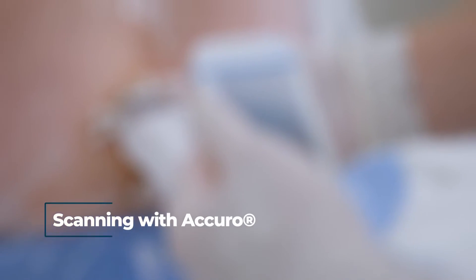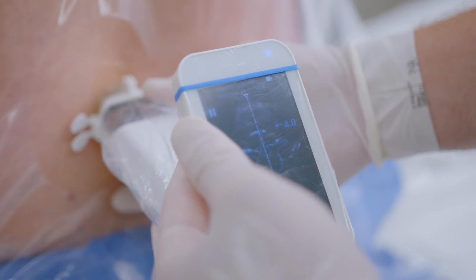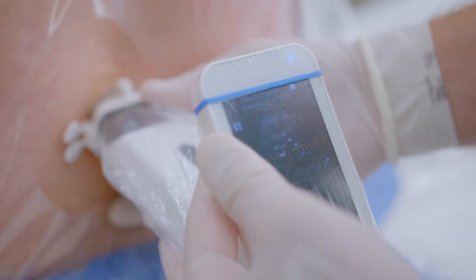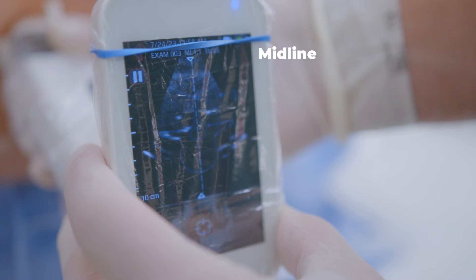When scanning with Acuro, scan with your dominant hand under the Acuro. Scan slowly and horizontally — micro-movements are best. Scan with the same trajectory you typically use for injections. Identify midline, indicated when the vertical dashed line runs between the two triangles at the top and bottom of the ultrasound image.